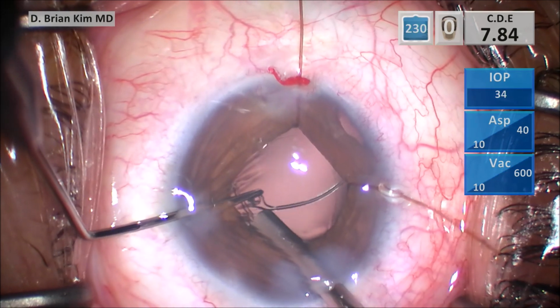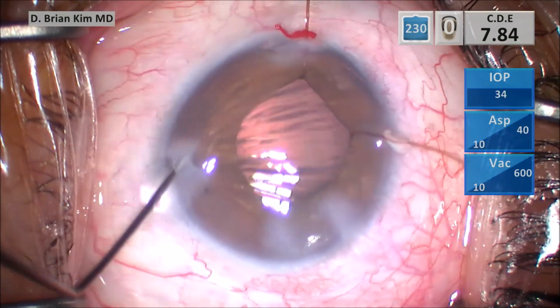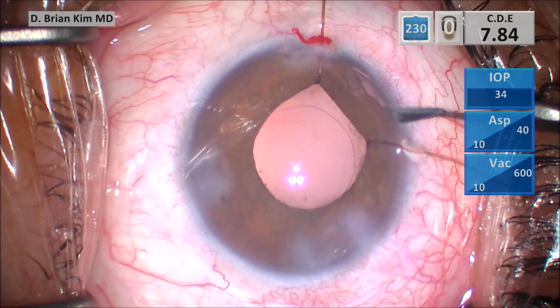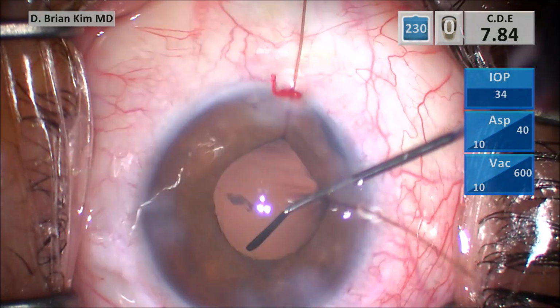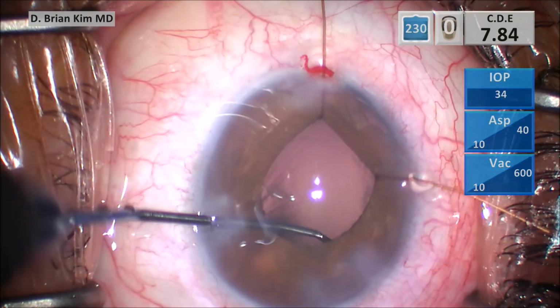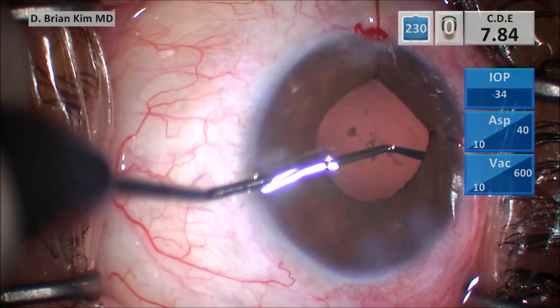Deliver, I'm compressing the CTR with the Lester, and then once I get the entire CTR in, you disengage each eyelet, which goes into the bag. Fairly simple, and this is the way I do it basically for every case using a CTR. By compressing the CTR into a smaller diameter, it minimizes the stress on the zonules. Using the capsule sweep to polish underneath the rhexis edge on the left side and then the right side.